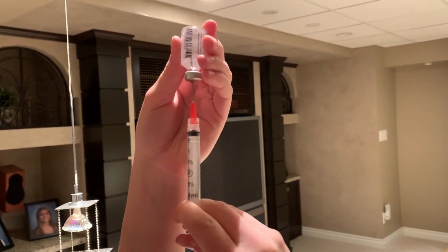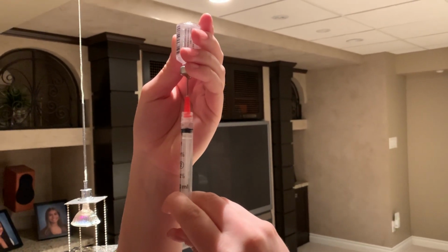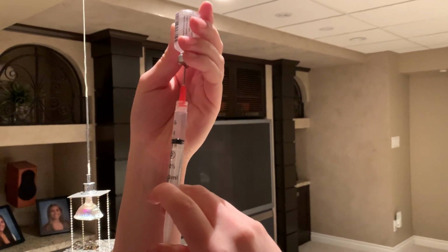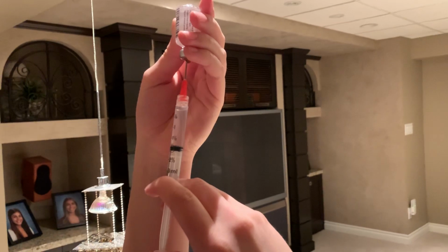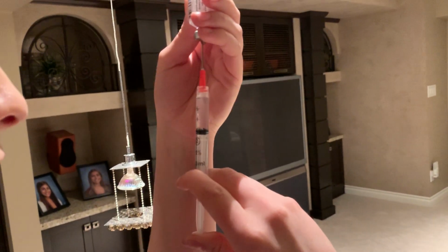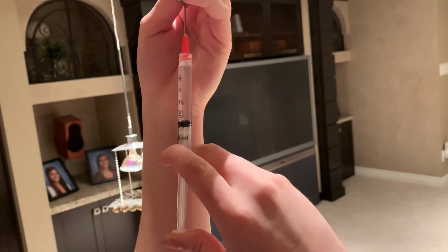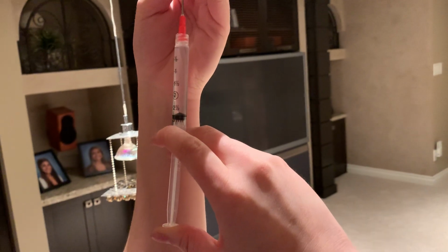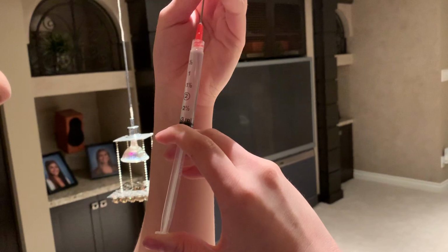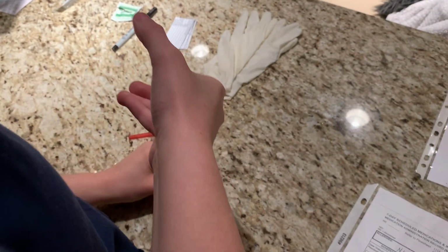And then I'll slowly draw up the medication. Okay.